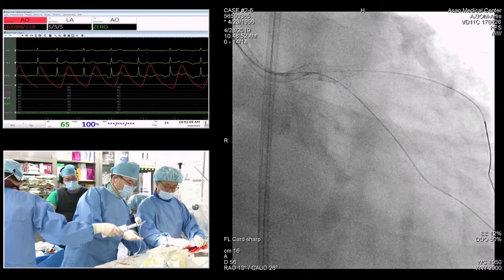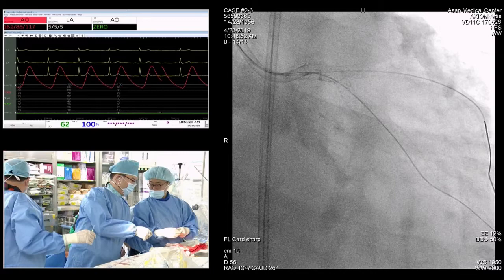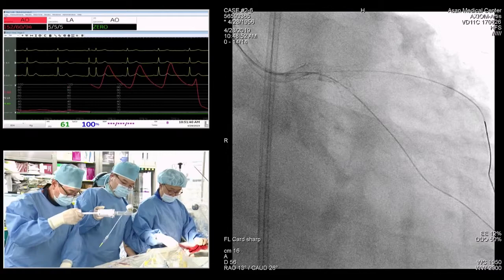Great. So they probably need to end up with two 4.0 non-compliant balloons at high pressure. Patrick and I were saying it really takes about 15 seconds of inflation to get the pressure in the balloon and really expand it. In 90% of live cases, this is not unique, it's up and then down. It really doesn't get the pressure in the balloon. It's like a race: who can get the balloon inflated the fastest? Of course, in the left main you don't want to stay inflated excessively, but here the pressure is 160.